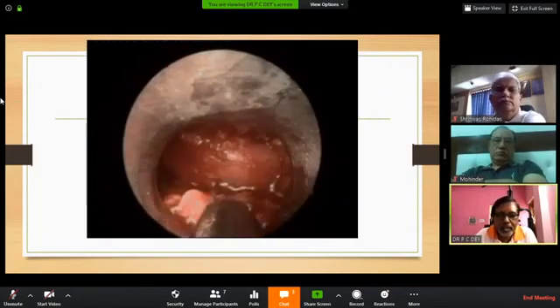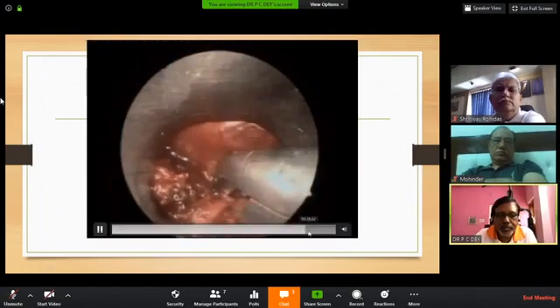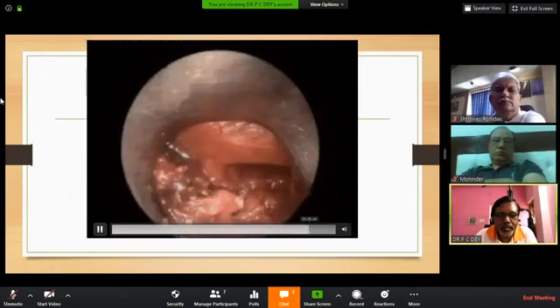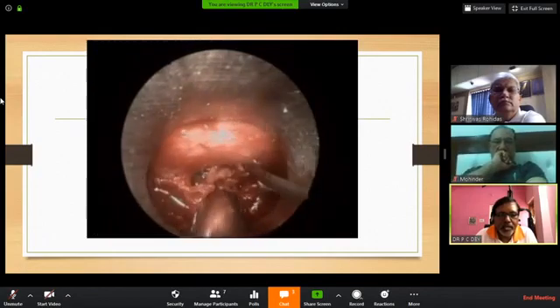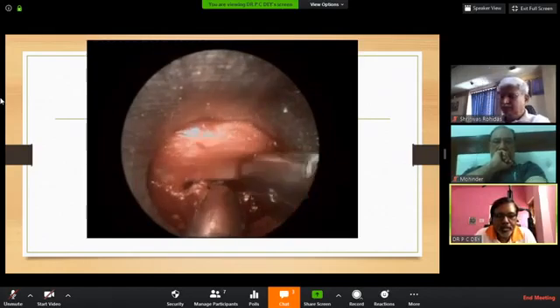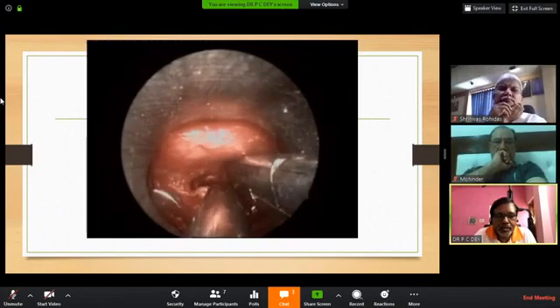So again, I just tried to search and dissect a little more laterally, and make my neural tissue a little more free. Now something is visible. Maybe that is the real culprit.